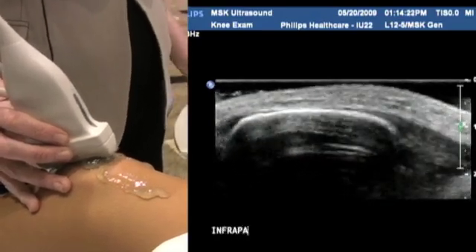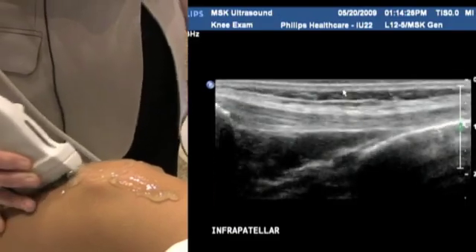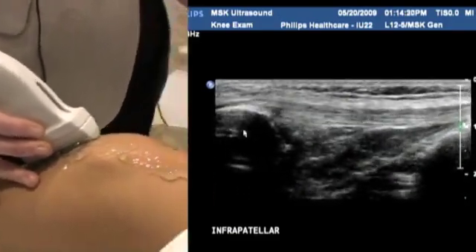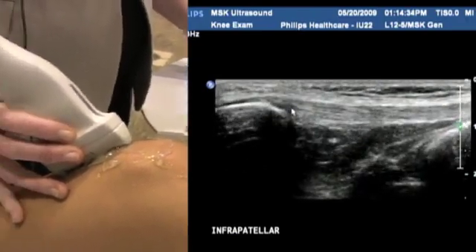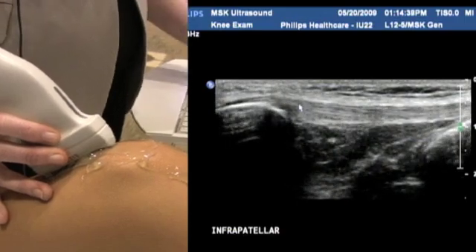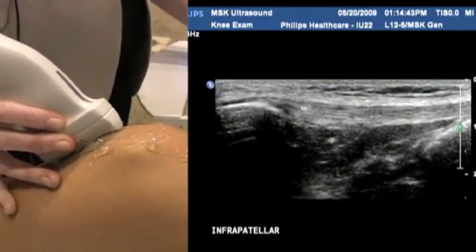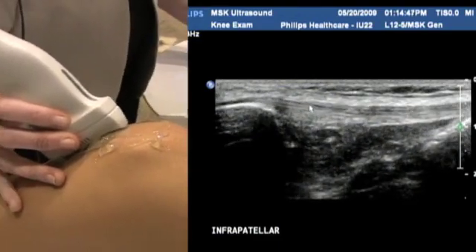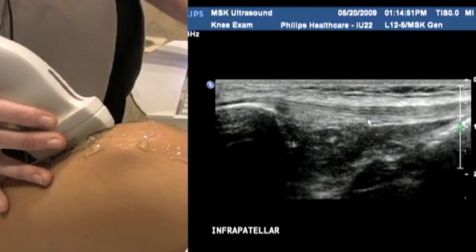So on we go to the infrapatellar portion of the knee. So infra obviously meaning below, so below the patella here. This is the superior portion of the patella tendon. Again, you see it's a nice homogeneous tendon. Again, some people call it the patella ligament. Either is perfectly fine. The fibrillar pattern of the tendon is nice and smooth and even. There's no interruption to the pattern, the linear echogenic pattern here.